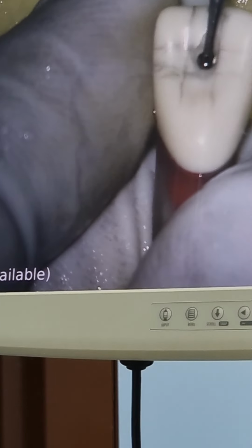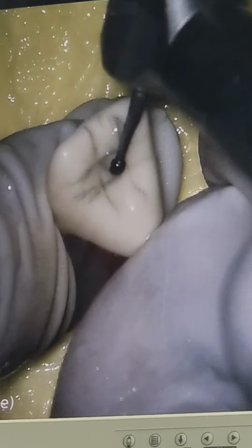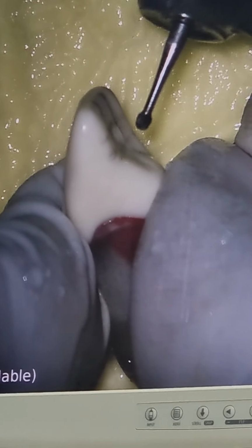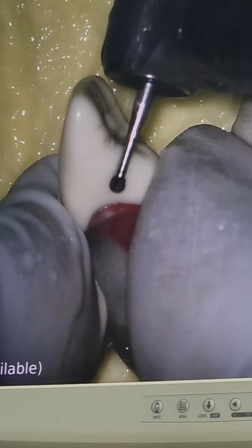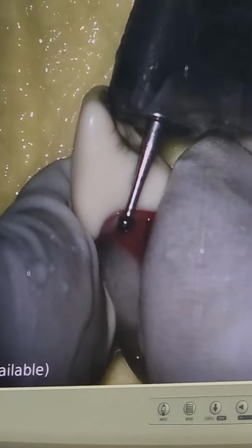Angulation should be parallel to the long axis. Don't make it more buccally, mesially, distally or lingually tilted. Keep it parallel to the long axis, and the tip of the bur, very important now, should always be directed towards the center of the tooth, towards the pulp.